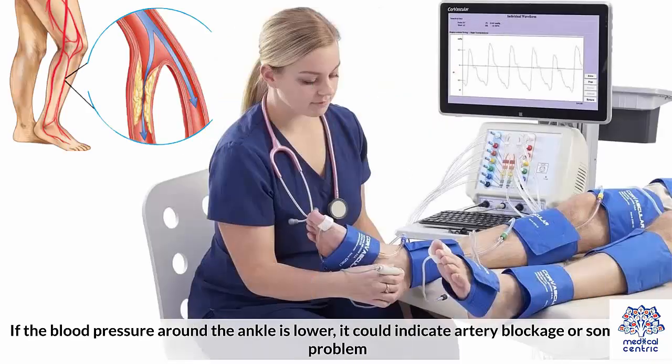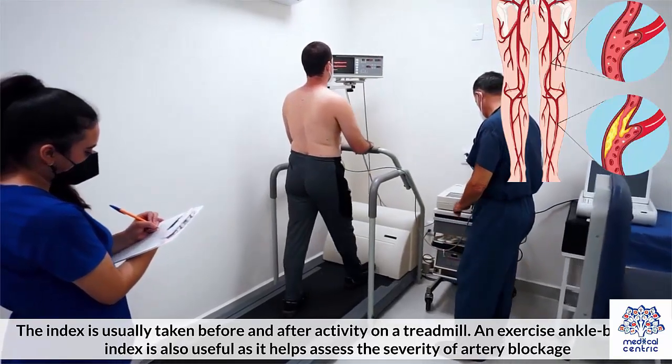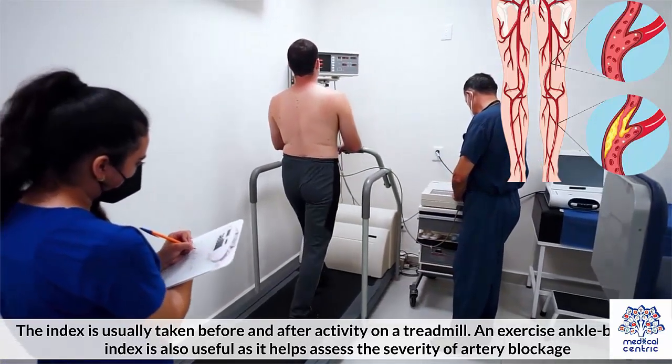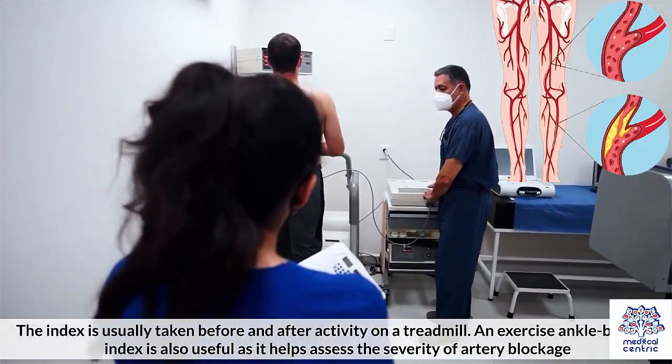If the blood pressure around the ankle is lower, it could indicate artery blockage or some other problem. The index is usually taken before and after activity on a treadmill. An exercise ankle brachial index is also useful as it helps assess the severity of artery blockage.